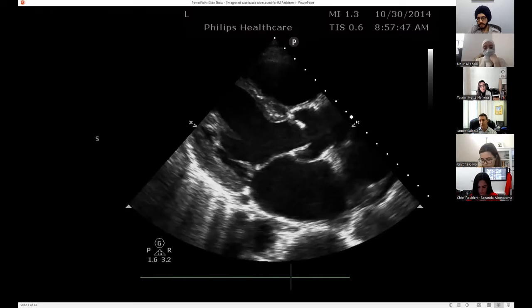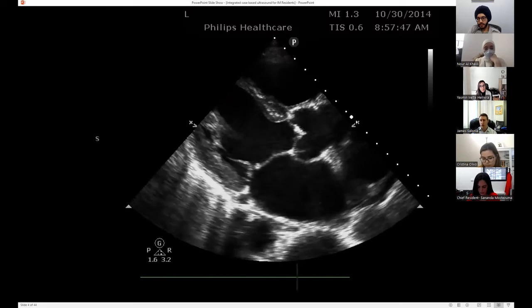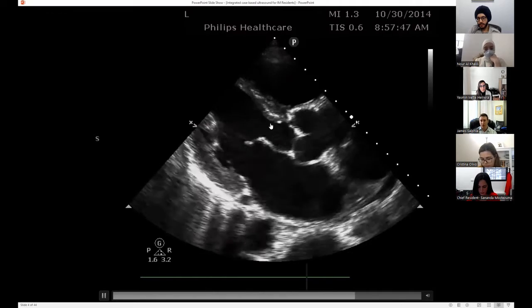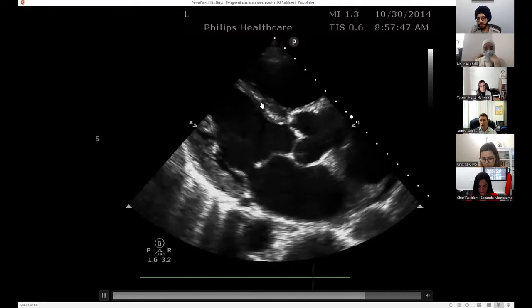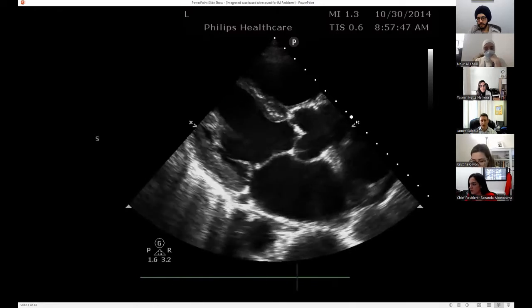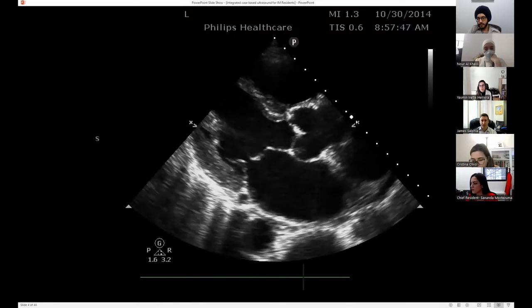So again, these views, there's limitations with interpretation here. So if I have a valve which is completely blown and it's slapping the septum here, it tells you nothing about ejection fraction. It just, the septum, the leaflet's all over the place.